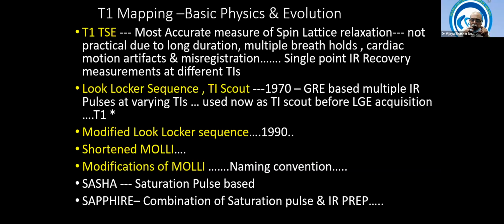And after preparing this sequence, Dr. Look-Locker received emails from the people who had modified his sequence, stating that they had named this sequence after him, known as the modified Look-Locker sequence, and hereafter it is called that, because they used the Look-Locker technique, with multiple RF pulses and inversion recovery, as the basis and modified it.